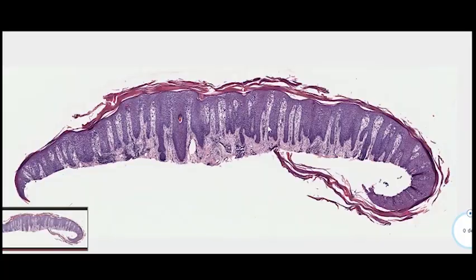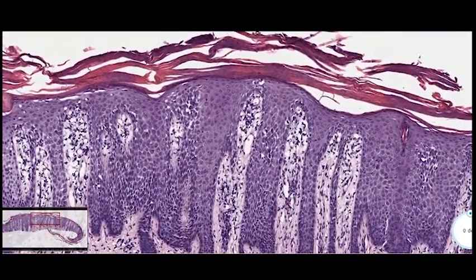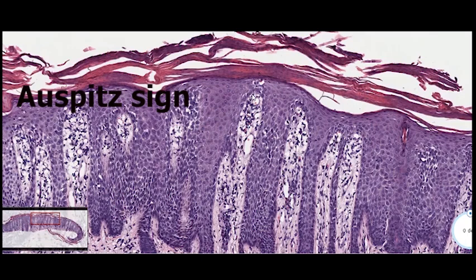Okay. Also, you can see the blood vessels. The blood vessel is very important in psoriasis. You will see all this white space lined with endothelium are blood vessels. So we have dilated tortuous blood vessels in the papillary portion. The dilated tortuous blood vessels with the thin suprapapillary portion are responsible for what's called Auspitz sign. If you scratch the skin, you will remove the scale layer by layer until you have this pinpoint petechiae due to the dilated tortuous blood capillaries.